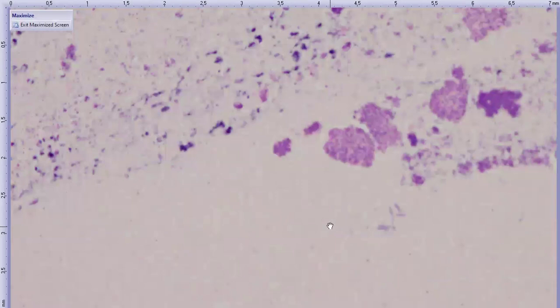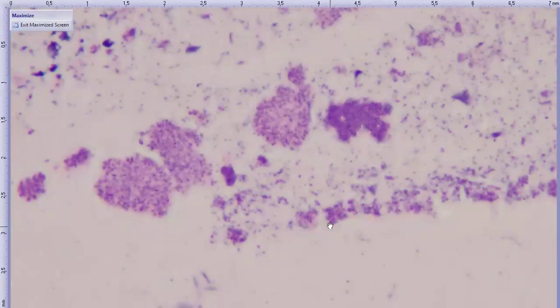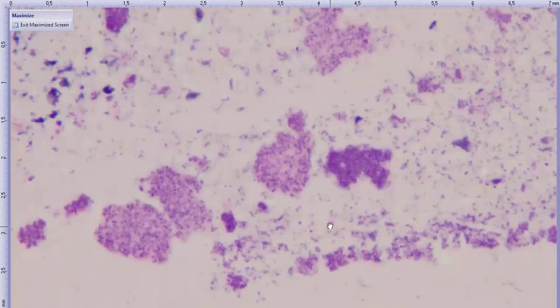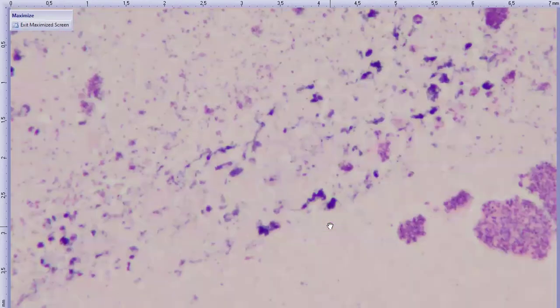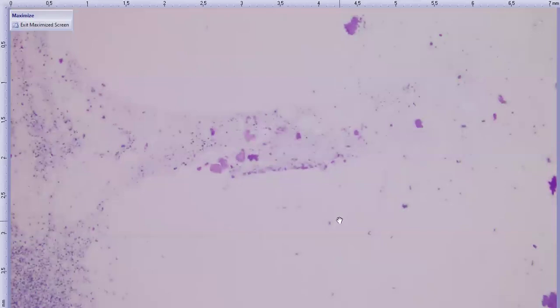And then as you can start to pick up, this is what bacteria should look like on H&E, this much more vibrant dark purple. So that's as high as we can go, sadly. So these are some fairly large bacterial cocci. Whenever you see very large bacterial cocci, usually it's going to be staphylococcus of some sort. We don't have culture results in this case to confirm that, but we sort of assume that it's staphylococcus.